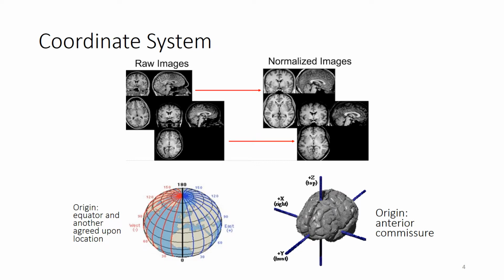Everybody's brain is shaped differently. This seems obvious, but presents a problem for experimental research. fMRI records data in a fixed coordinate plane. That is, no matter where the participant's head is located, the 3D box data are collected in stays in a fixed location. The coordinates for one person's midbrain might be different from another. How can we compare coordinates of activation across participants then?